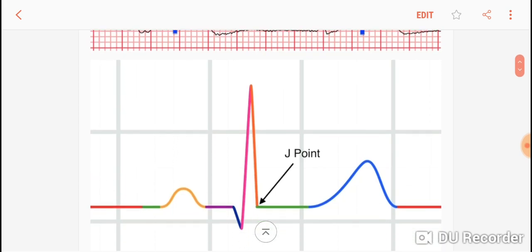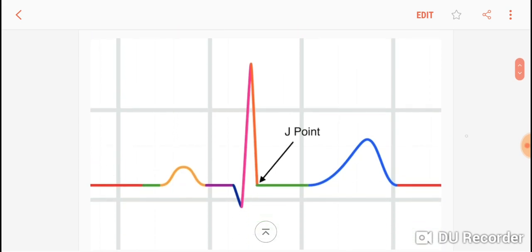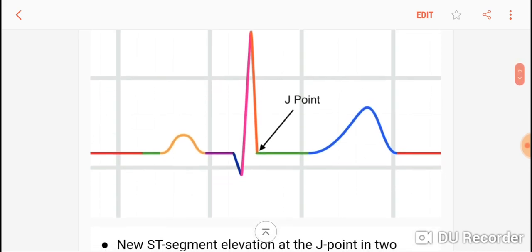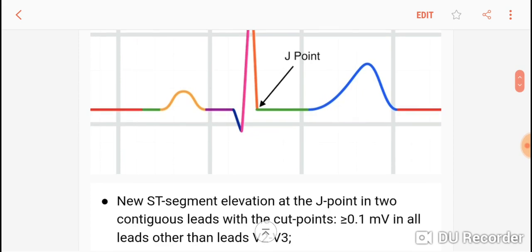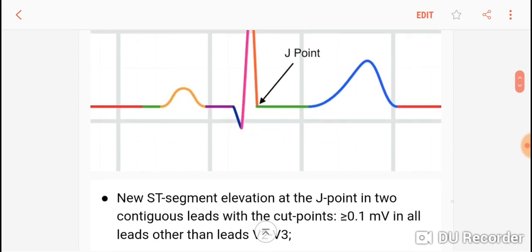First and foremost, you must know what the J point is. The J point is the point between the QRS complex and the start of the ST segment — the point where these meet. You must compare the J point to the baseline, which is the PR segment on the Y axis. Any elevation would be of the J point above that baseline.